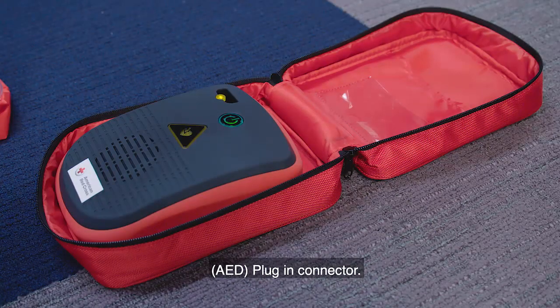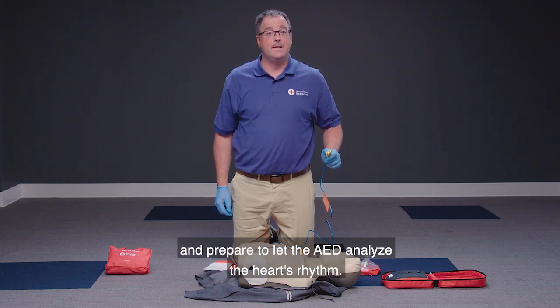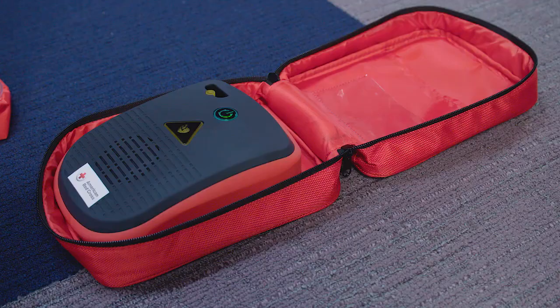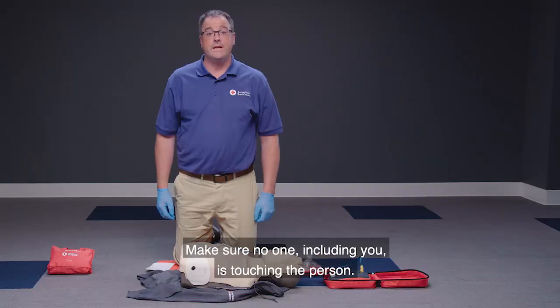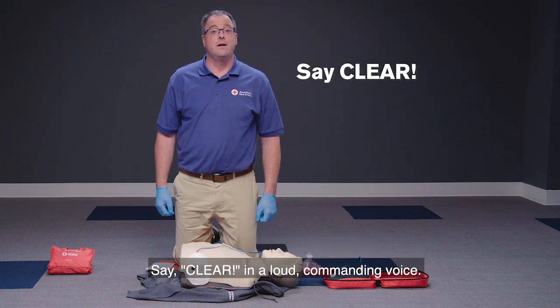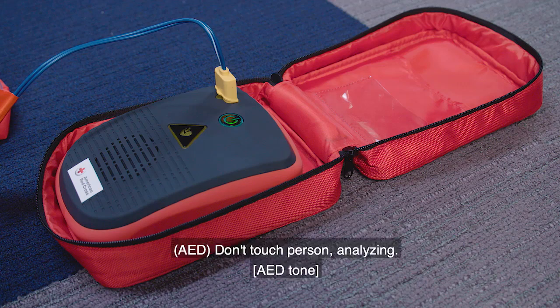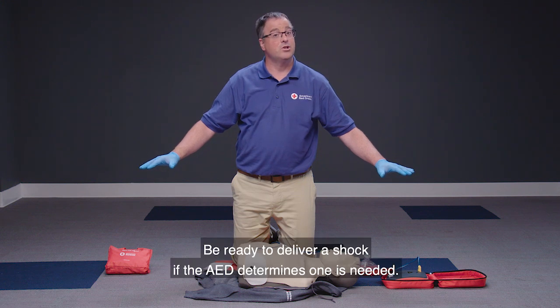Plug in the connector. Plug the pad connector cable into the AED if necessary and prepare to let the AED analyze the heart's rhythm. Make sure no one, including you, is touching the person. Say 'clear' in a loud, commanding voice and don't touch the person.